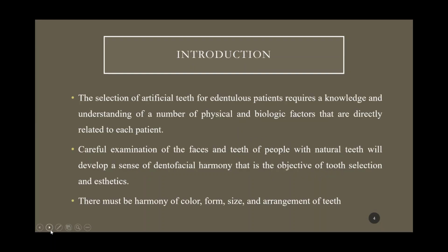Coming to the introduction, the selection of artificial teeth for edentulous patients requires a knowledge and understanding of a number of physical and biological factors that are directly related to each patient. Careful examination of the faces and teeth of people with natural teeth will develop a sense of dentofacial harmony that is the objective of tooth selection and aesthetics.